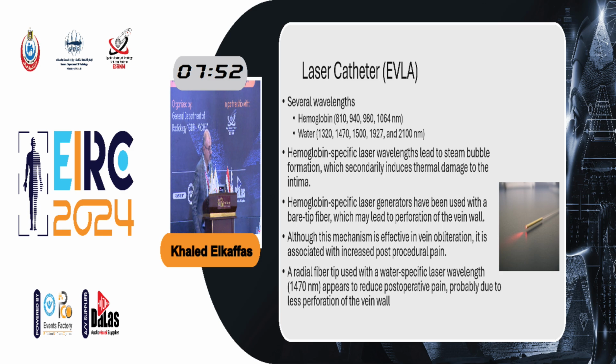Let's talk about laser, the second modality and the most popular modality in ablations. We have several wavelengths, either hemoglobin-specific, like all these mentioned wavelengths, and the newer ones are water-specific laser, mainly 1470, and the newer one is 1927 nanometer wavelength.